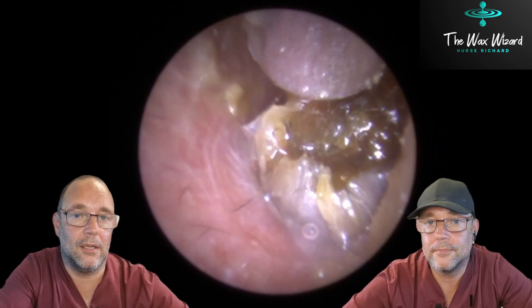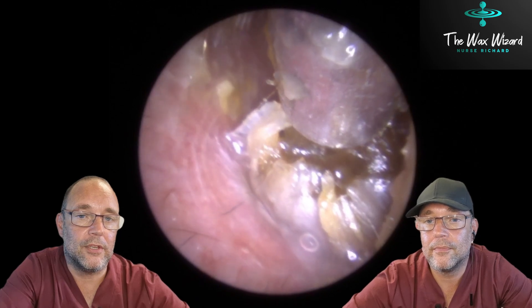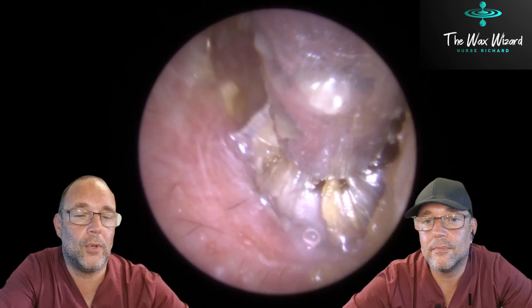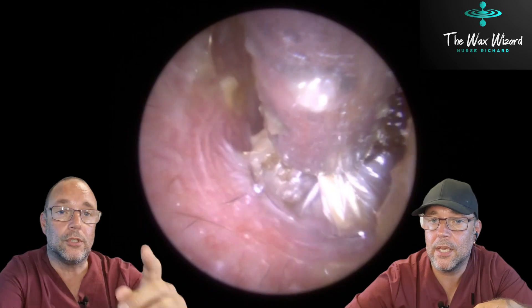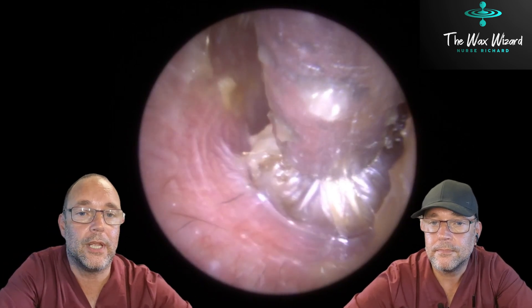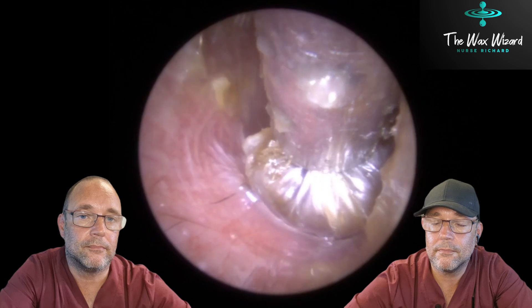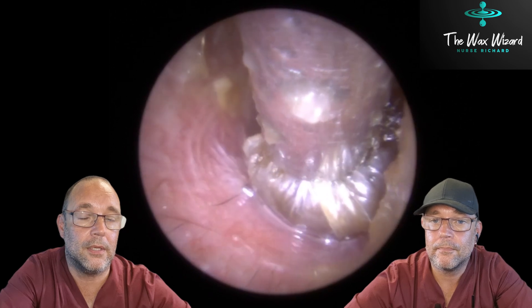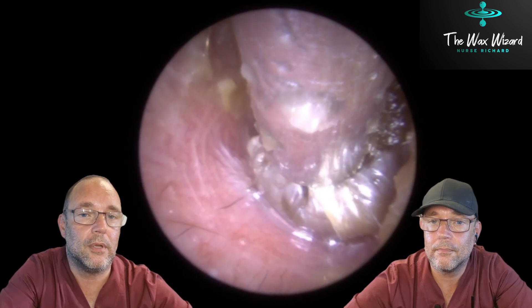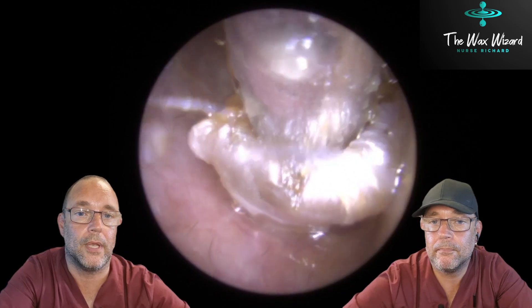But it's going to make this a lot easier. You should have done it sooner. A little blurry wobble there. I'd have done it by now. But as soon as we get a good grip of this and lift it up a little bit, the oil seeps down underneath it. How does that help get it out, Bob? It helps to lubricate the ear to slide it out — lubricates the canal wall — so when you get hold of it and pull it, it slides out a lot easier. And you can hear when you don't hear much of the air noise anymore — that means you've got a full seal and you can start pulling. You get some power. So here it comes. Out she pops. Another wax baby safely delivered. Well done.